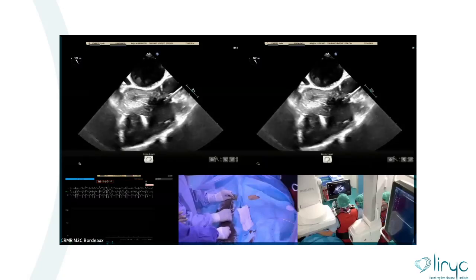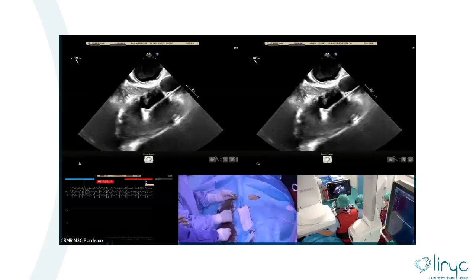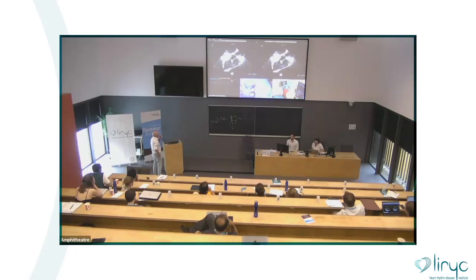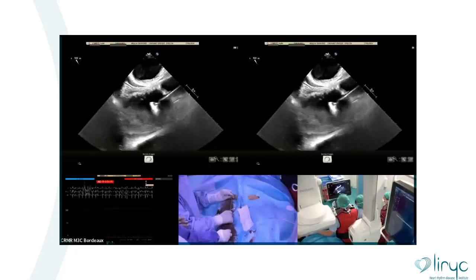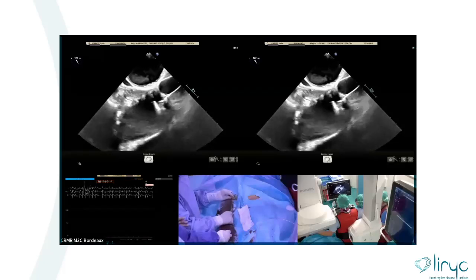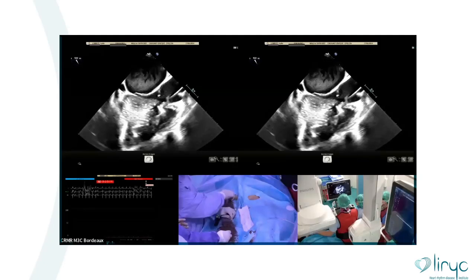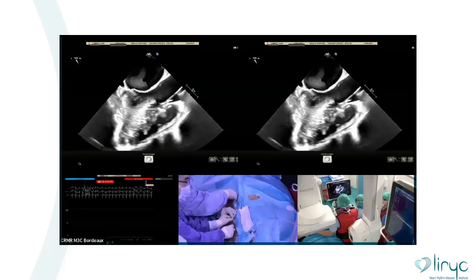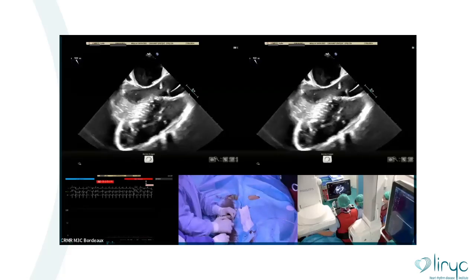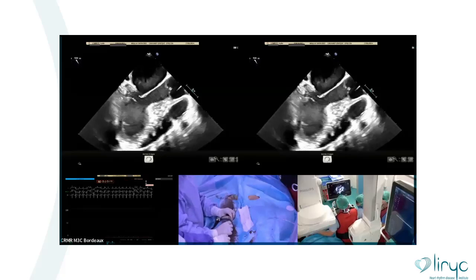Pull back the right disk. Mark, can you see the images? Put the whole system back. Yes, very good, we can see the right disc. The right disk is coming close to the shunt. So now we're gonna pull the whole system. Short axis view. Stop there.